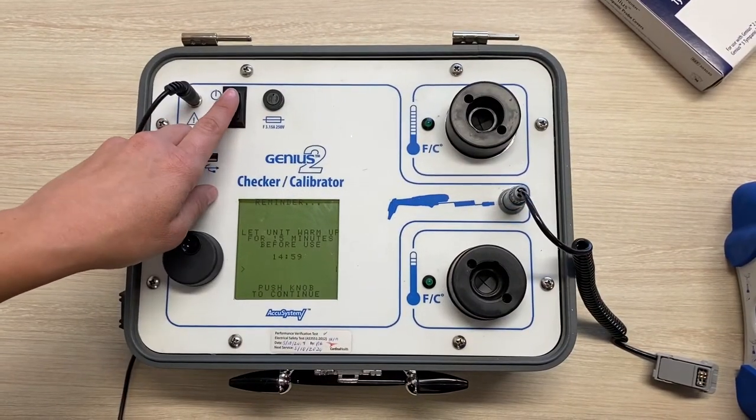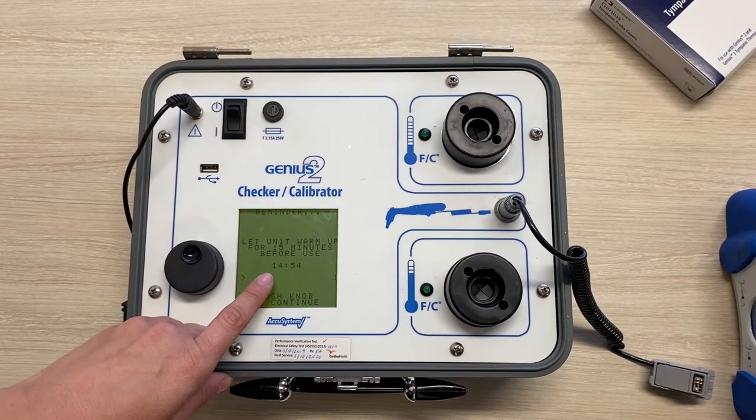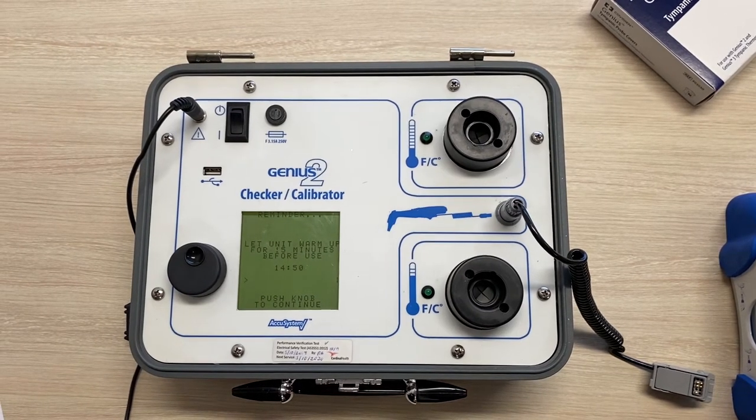When it's first switched on you'll get a message that you should allow 15 minutes for it to warm up. This is to allow the unit to adjust to the ambient temperature and ensures the targets are stable.